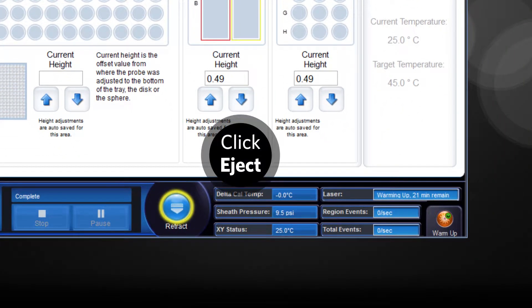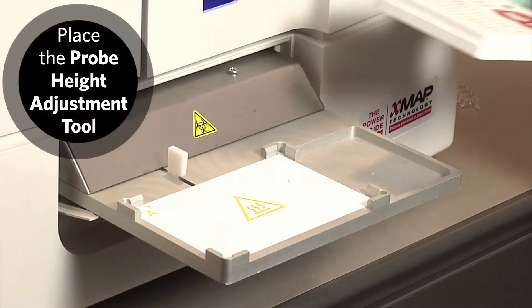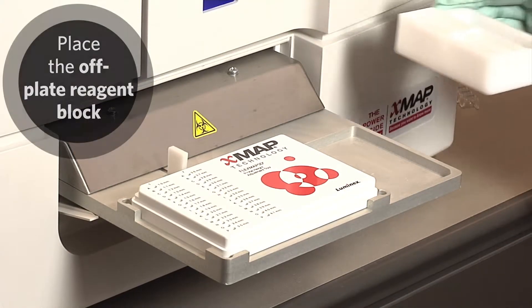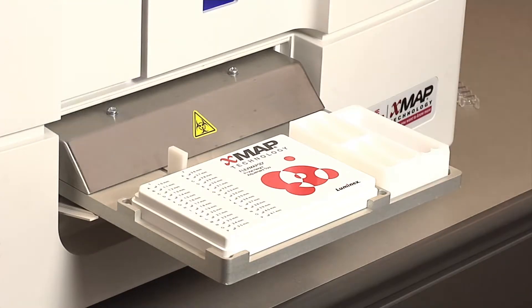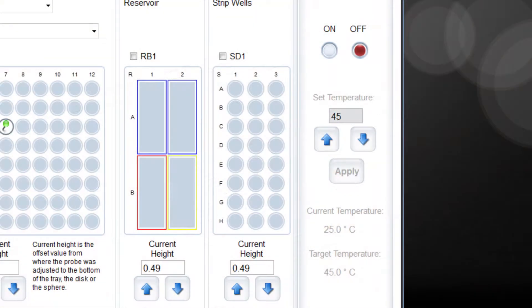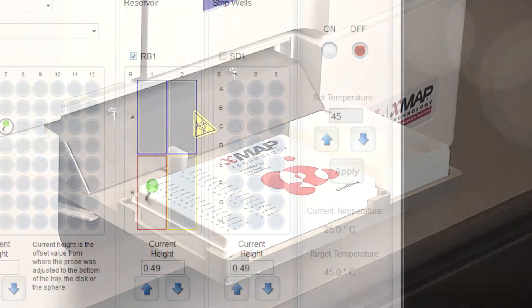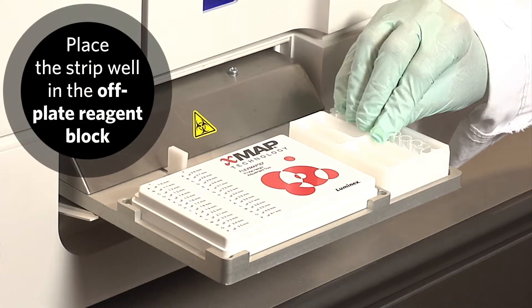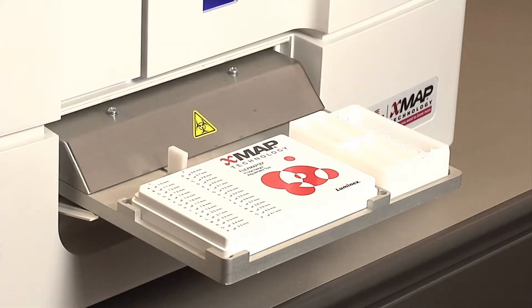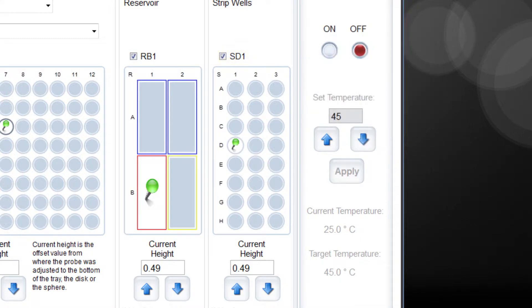Click Eject to eject the plate carrier. Place the probe height adjustment tool on the plate carrier with well A1 in the marked position. Place the off-plate reagent block on the plate carrier. Verify the reservoir is empty. By default, well RB1 is selected in the reservoir section. Place the strip well provided with the calibration and performance verification kit in the off-plate reagent block. In the strip well section, SD1 is selected by default as indicated by the green pin.